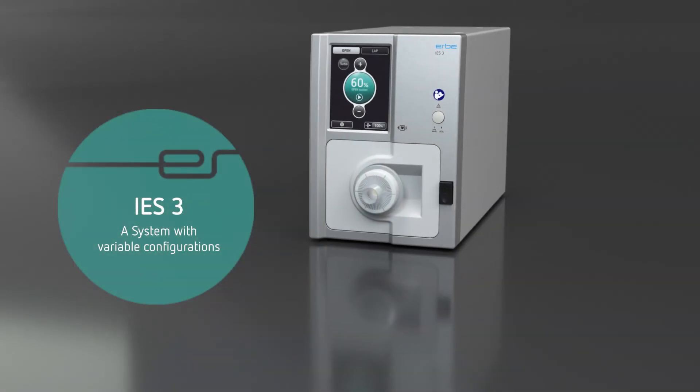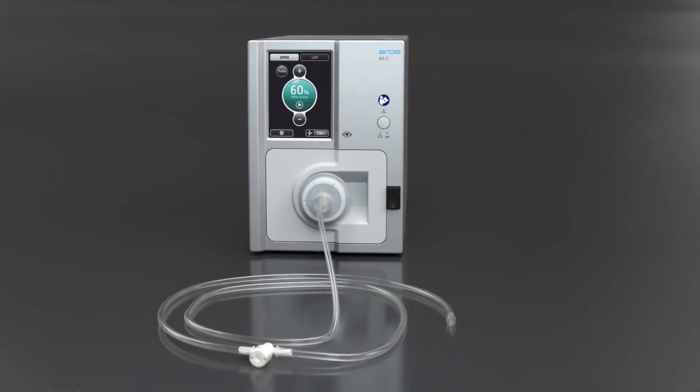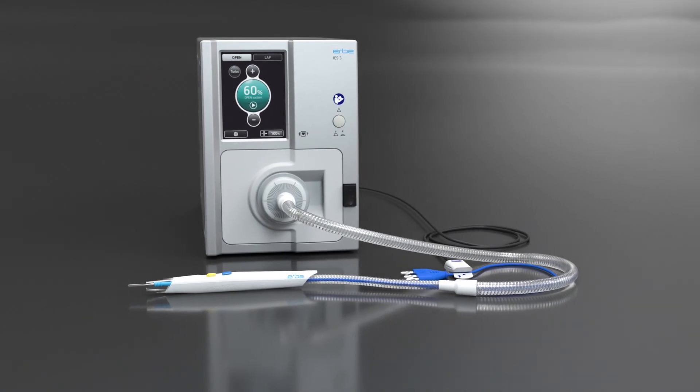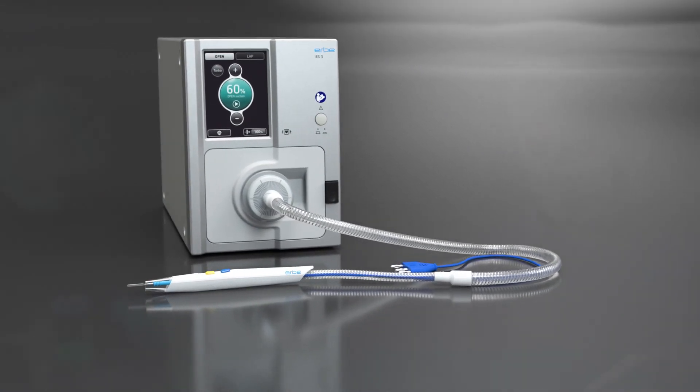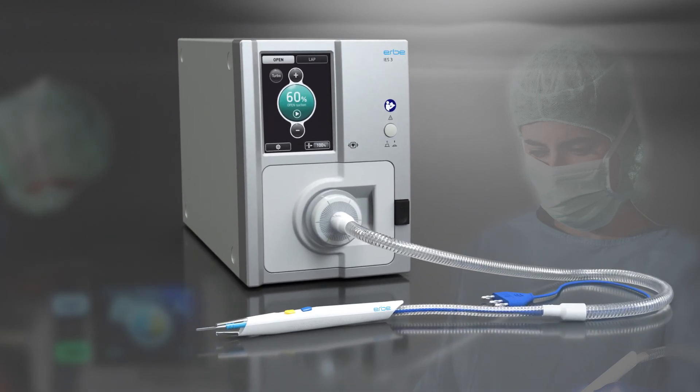The IES-3 smoke evacuation system can be configured individually. We offer special instruments and a wide range of accessories for numerous application options. Smoke evacuation by Erbe — all from one source.